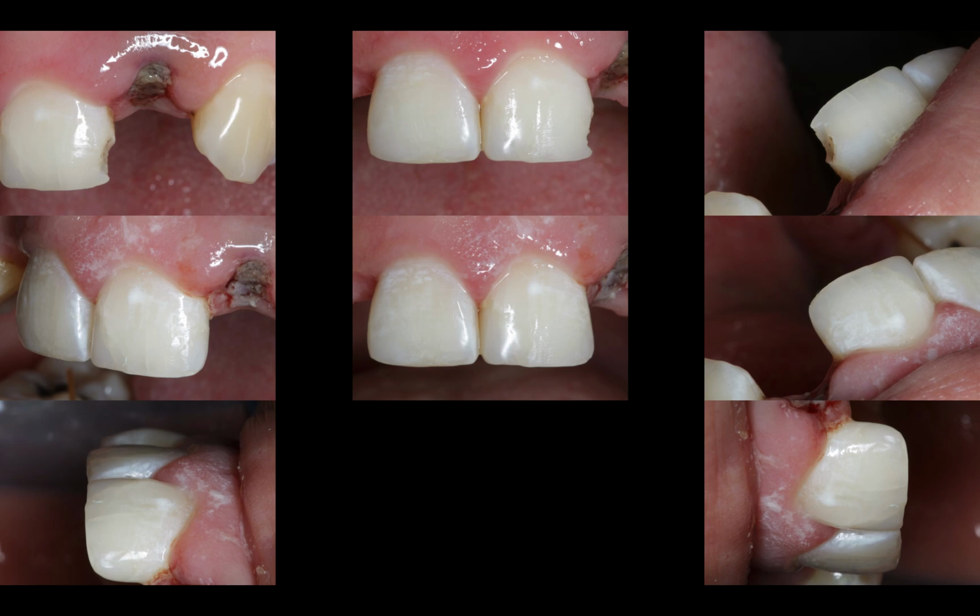So what we did is we coordinated with the oral surgery resident clinic as well as the orthodontic resident clinic to extract tooth number 10, 21, 28, and the supernumerary 78 all at one appointment. Immediately after that, in the Graduate Orthodontic Clinic, Dr. Mana Naeem fabricated a stay plate for the patient to wear to close the number 7 and number 10 edentulous areas. This is 4 days post-operative. You'll see that there was some iatrogenic damage by the operator when they extracted number 10.